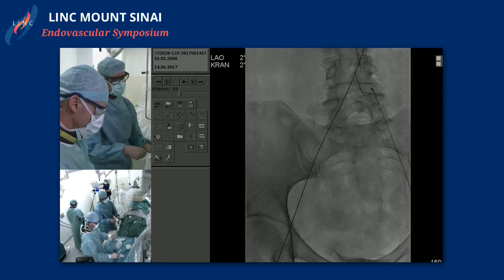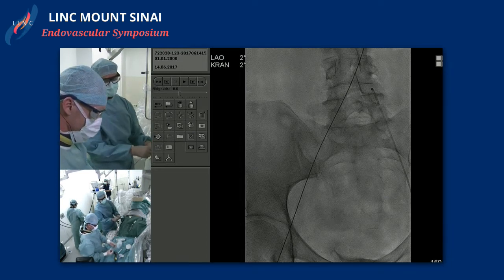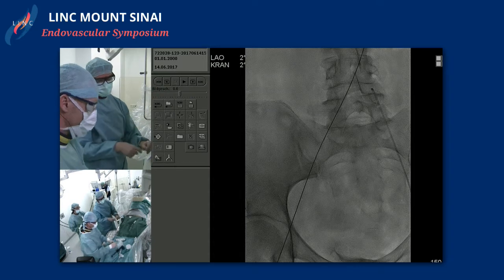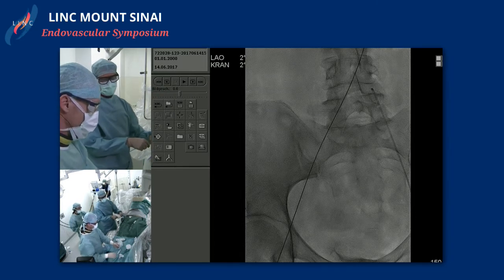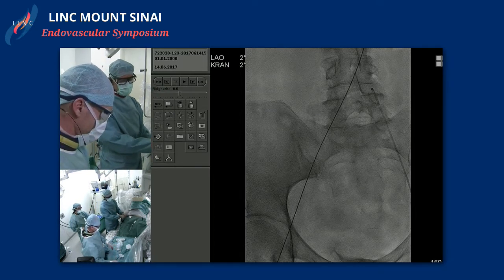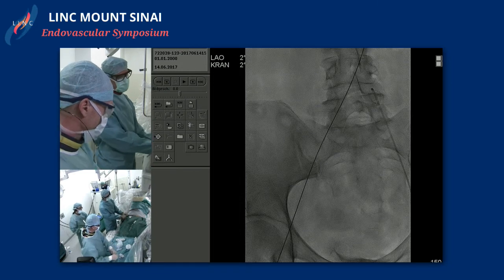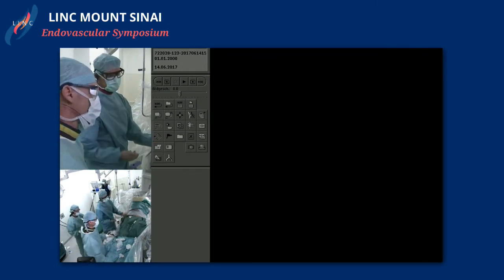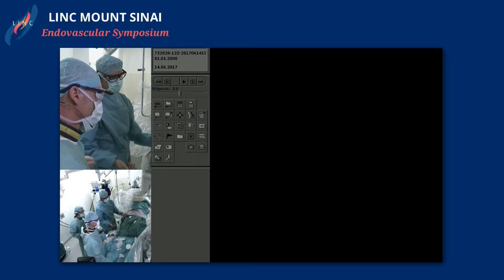So it's not only stiff proximal, where it's a closed cell part, then there comes a little piece of open cell, and then a second part, which is closed cell in the proximal external vein. And thereafter, I think it depends. It should be more flexible, especially when you come through the ligament into the common femoral vein.